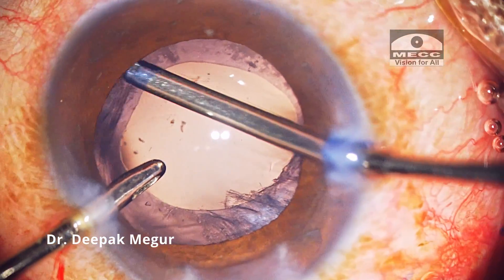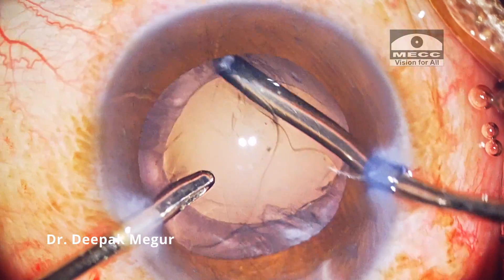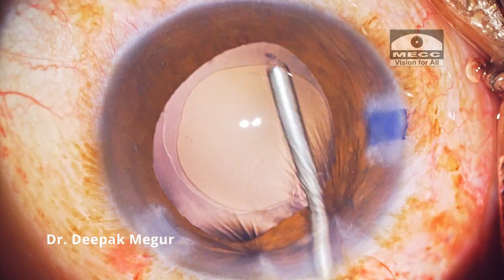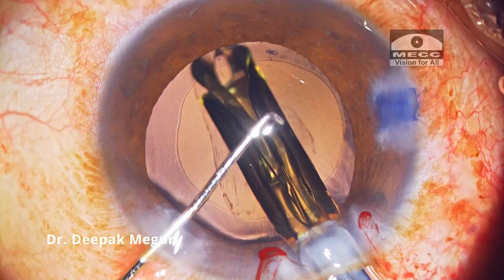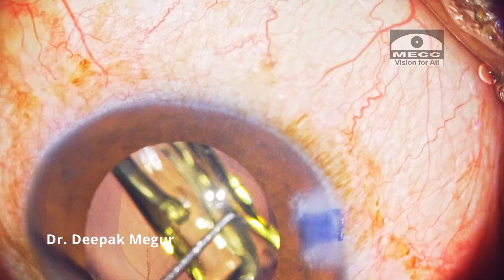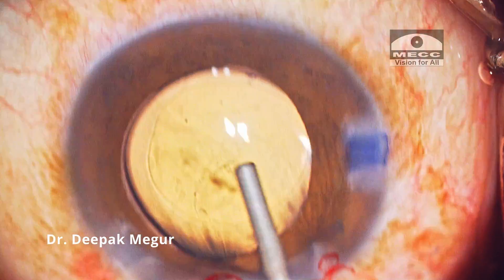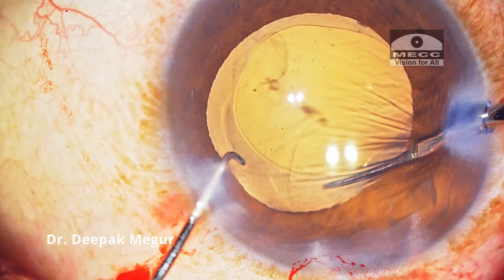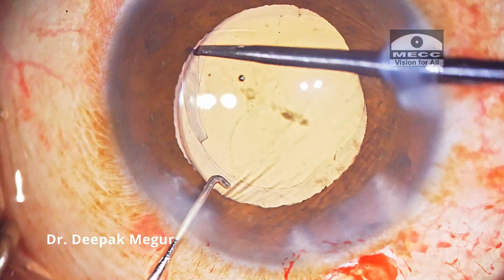The cortex is then aspirated out. I'm using HPMC to form the bag and the lens is placed in it. I feel that the rhexis is slightly smaller, so again I'm using micro scissors to cut the capsule tangentially. The flap is held with the forceps and the rhexis is enlarged.